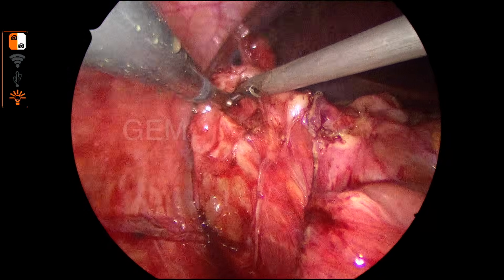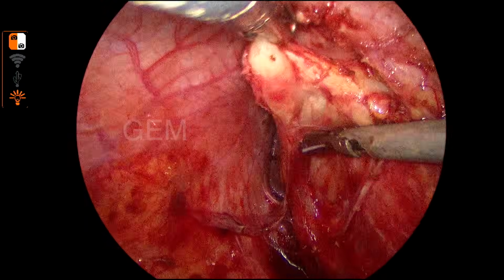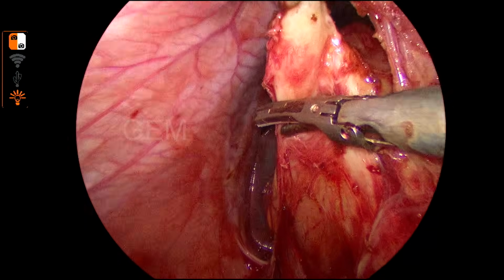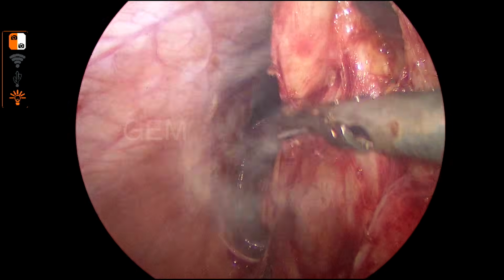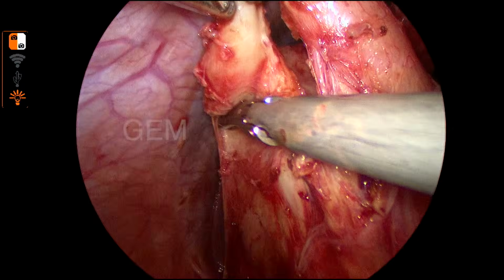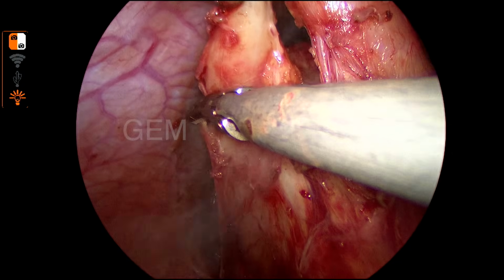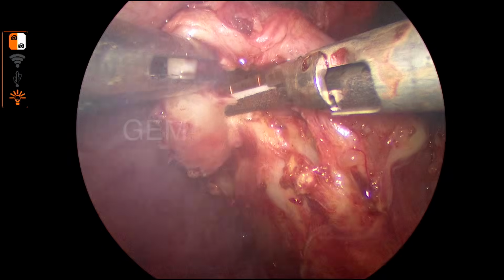So our aim is to mobilize the appendix without cecal injury. That's why the cecal posterior attachment is there. If you pull it with the appendix, then the posterior is also attached, so you are pulling in one direction, and the chance of a tear of the cecum is there. So that's why I released it posteriorly. So if I pull the appendix, it will not tear.